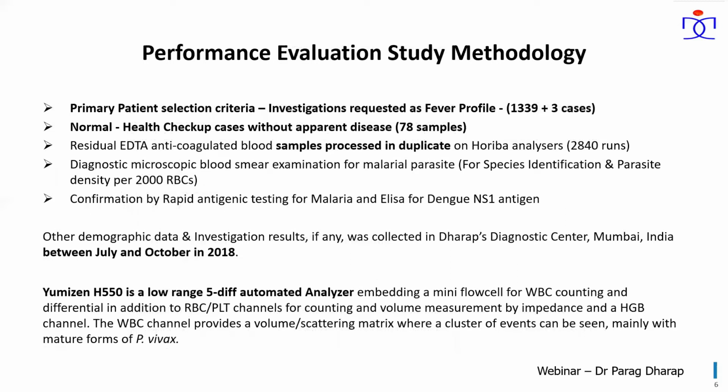Now comes the last testing step. For any Indian clinical setting, the commonest patient presentation is a complaint of fever, and accordingly the physician sends a request for a basic fever profile, which comprises full blood count with or without ESR, peripheral blood smear examination for malarial parasite, dengue antigen testing, Vidal testing for typhoid, and urine routine for any infections.